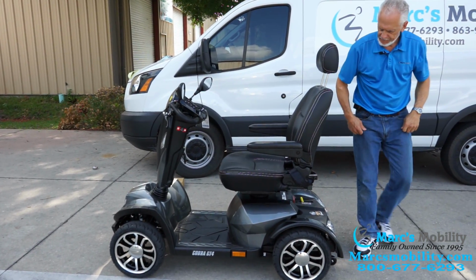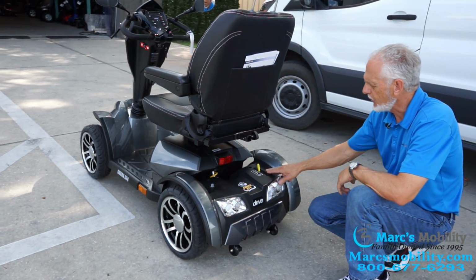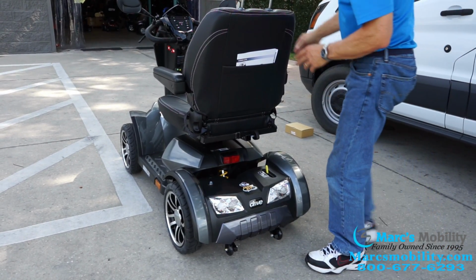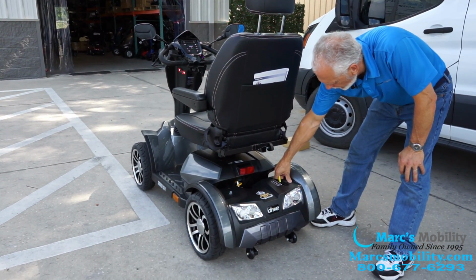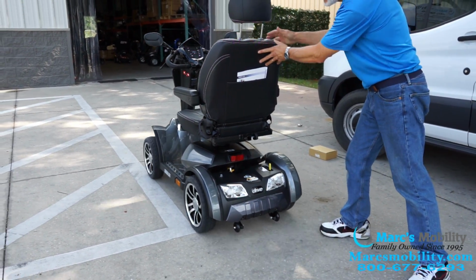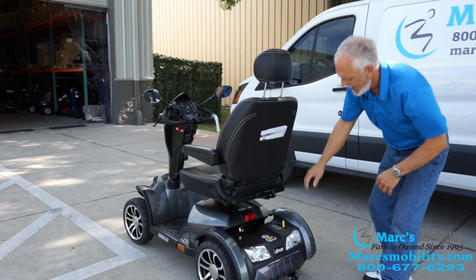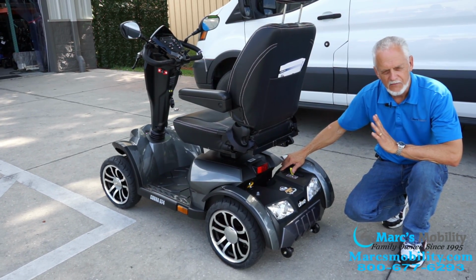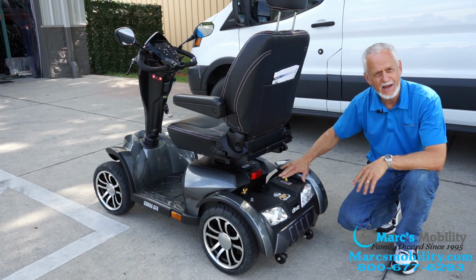Also in the back of this scooter, we have your neutral lever. So right now, you can see the scooter is in gear. It's not going anywhere. So if I turn the power off, and if I want to put it in neutral, I would just pull this lever and it tells you right there, neutral or in gear. So now I could roll the scooter if I had to, if it was in neutral, okay? What I'm going to do is put the scooter back in gear, because if you leave it in neutral, it's not going to drive. All the lights are going to come on, but it's just not going to move. So make sure you put it back in gear.